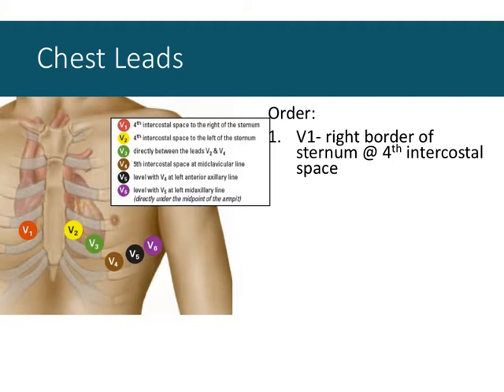I think everyone should be able to do a 12-lead ECG. We're going to try to do one during exercise. In the past, it's been really noisy. All the wires pick up a lot of static, and they bounce around a lot, so there's a lot of noise in the signal, and you can't really see it. But we'll try it this year. If not, everyone can do one at rest, at least.